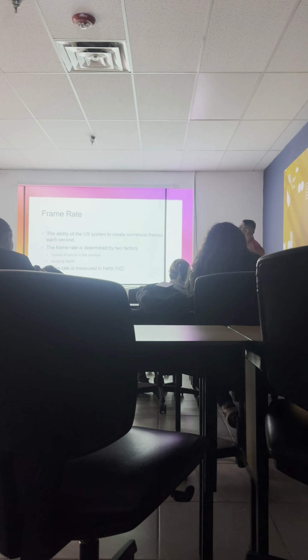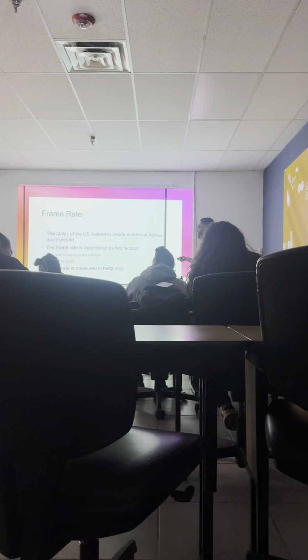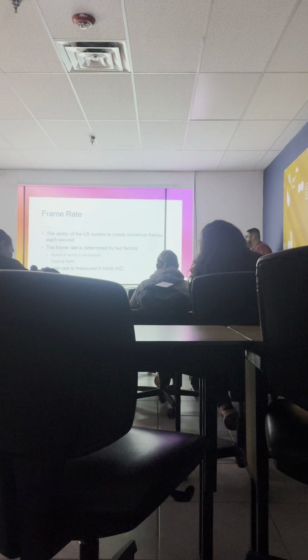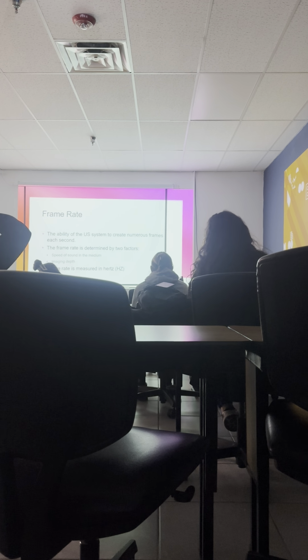Frame rate is determined by two factors: the speed of sound in the medium and imaging depth. First of all, why does the speed of sound in the medium influence the frame rate? We're going to be able to pick up the returning. I think what you're trying to say is that if your speed of sound is lower, it takes longer for the echo to return.